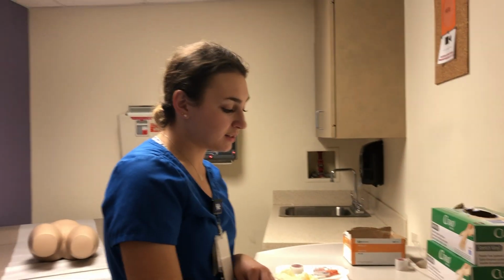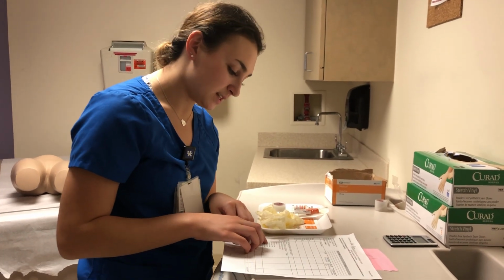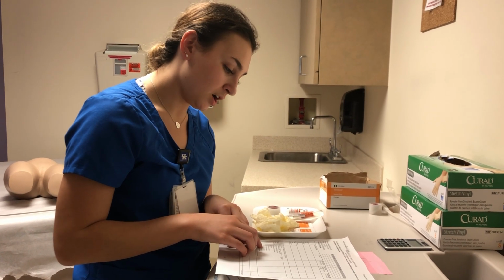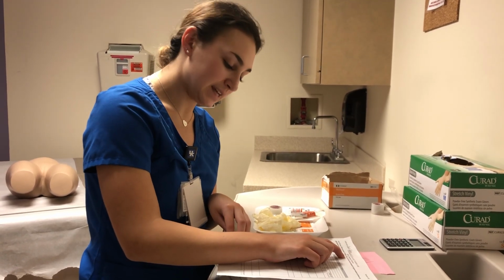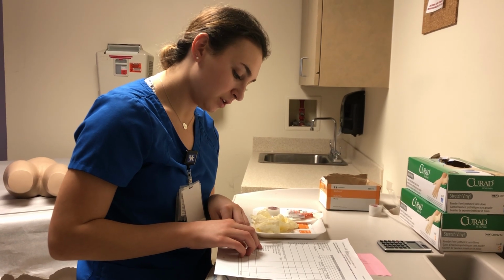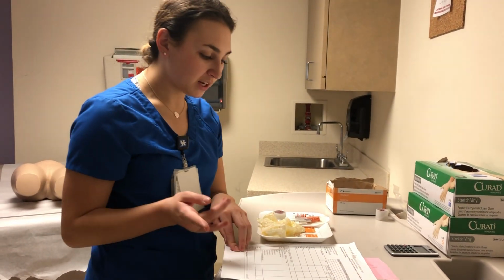I know this because the blood sugar level that has been tested in my patient is 258, and my MAR says that if the blood sugar level is between 251 and 300, that I am to give 6 units. So I'm just going to double verify. The blood sugar level is 258, and my MAR says that from 251 to 300, I'm to give 6 units of regular insulin.